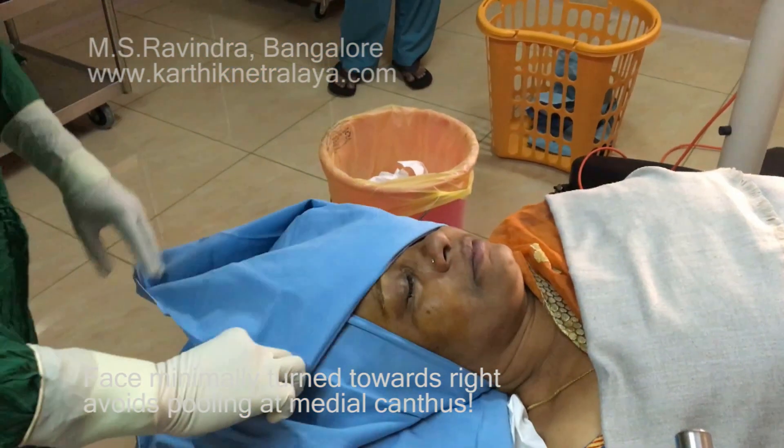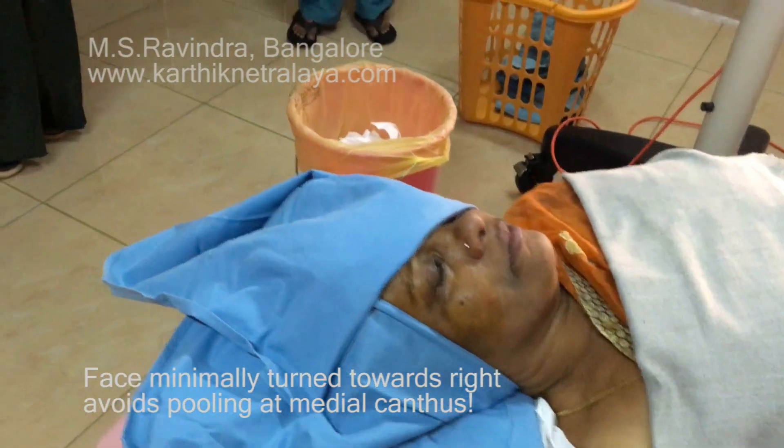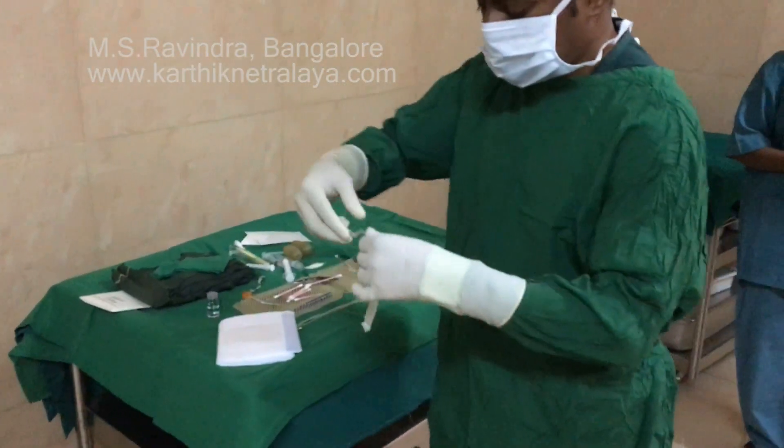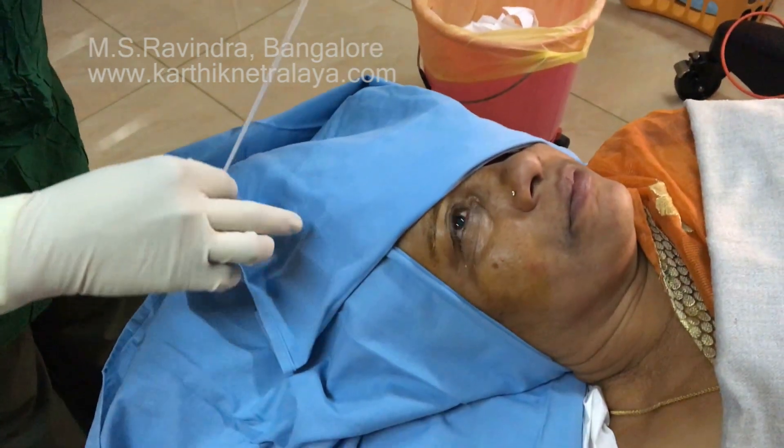See that sterile and unsterile areas do not touch each other. The surgeon has worn gloves and is sterile in all his attire, and he puts the drape without touching the unsterile areas.